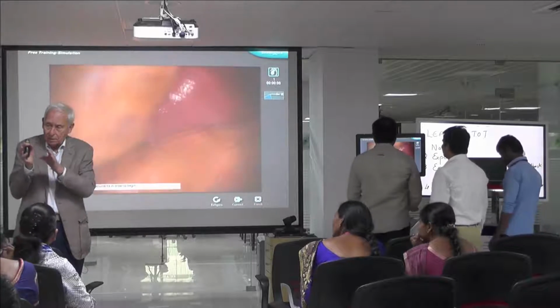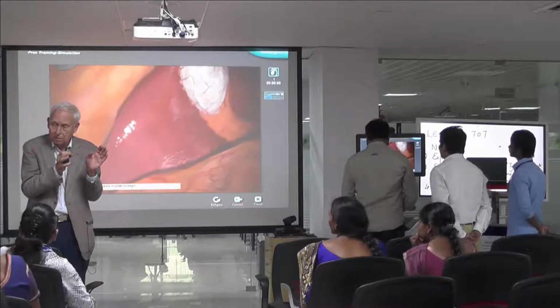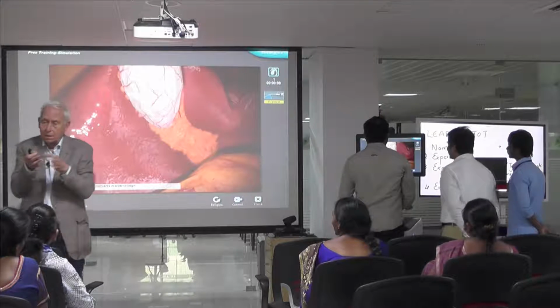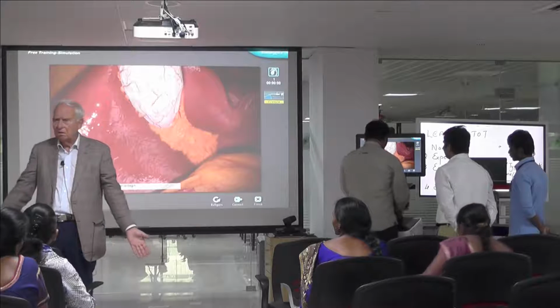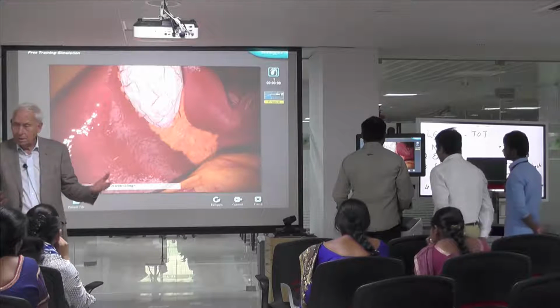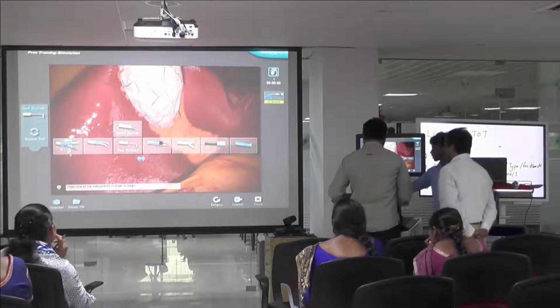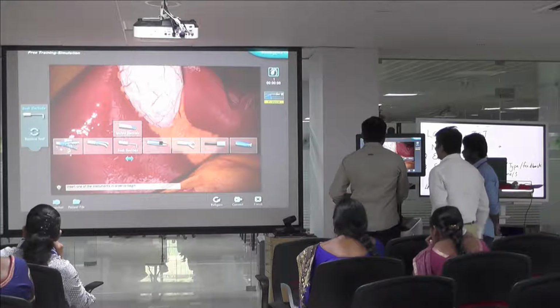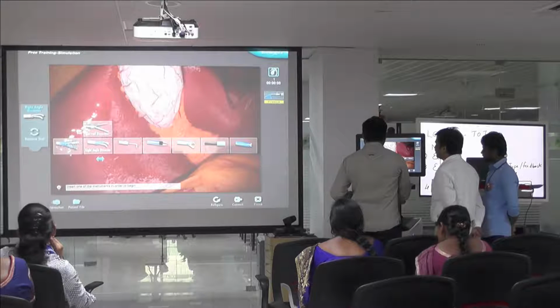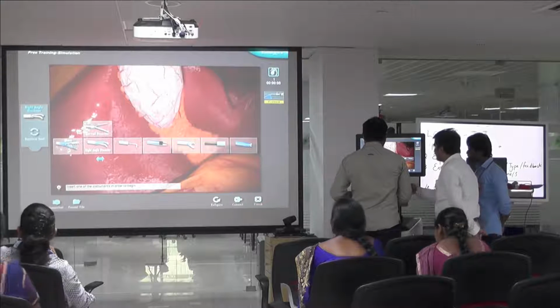And you indicate the regions of danger and you help in choice of correct instrument. Otherwise, people come, take something and are messing around, and then they come to you and you say, where did you learn this? From a machine. No. Yes, to use the instrument the way you want him to use it. And at the end of any procedure you let the trainee do, it should be as you like, that it looks like the image. Yes, correct.